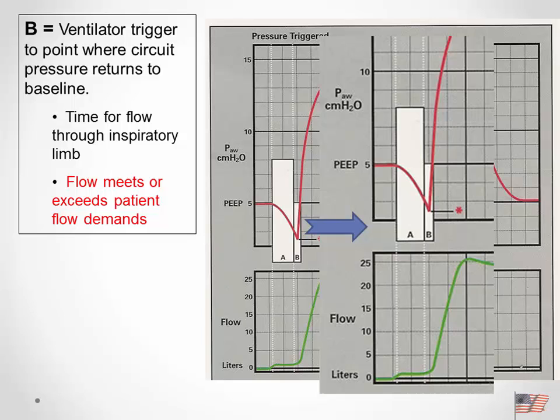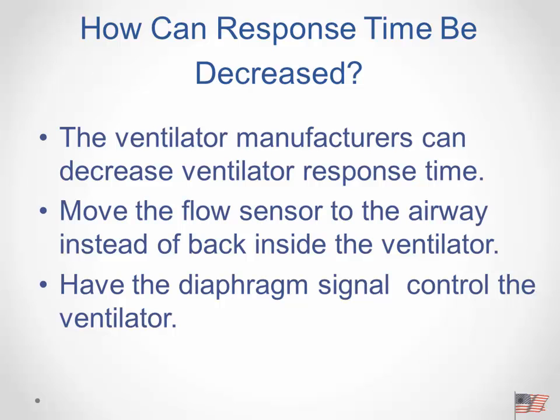Same is true when we have flow triggering. There's still going to end up being that delay present. So it doesn't matter if it's pressure triggering or flow triggering, is the bottom line there. So how can the response time be decreased?